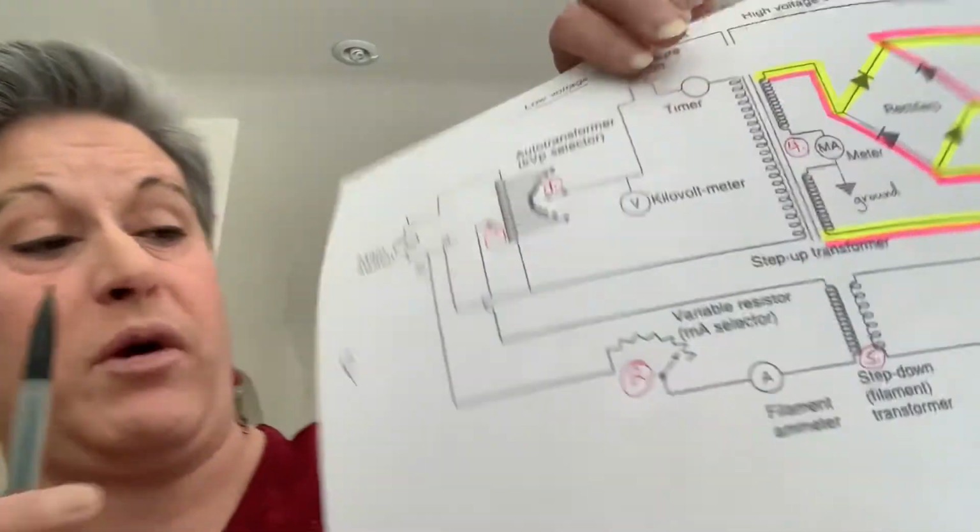Now, induction is a process of electrical fields acting on one another without contact. Through induction, electricity can cross over even though there's no contact. If there was a connection, the X-ray circuit would get confused and it wouldn't work. There are 6 locations where induction happens in the X-ray circuit and the X-ray tube. So I'm going to show you right now.